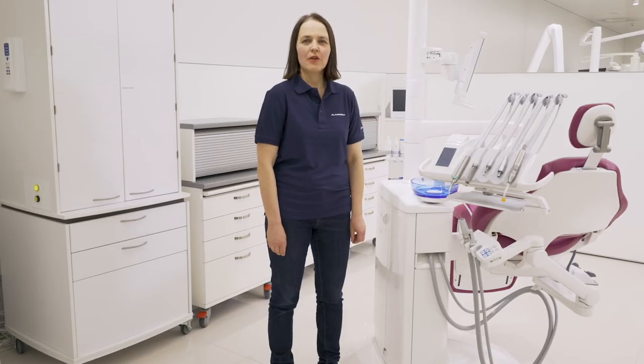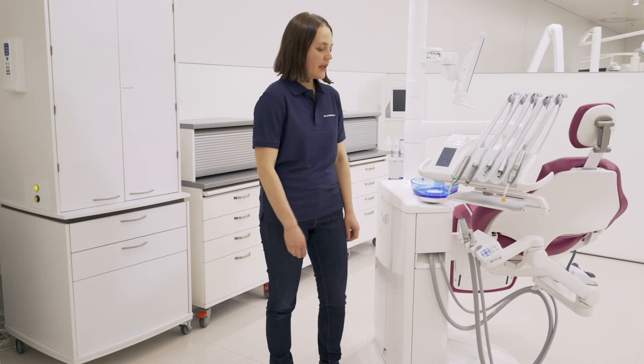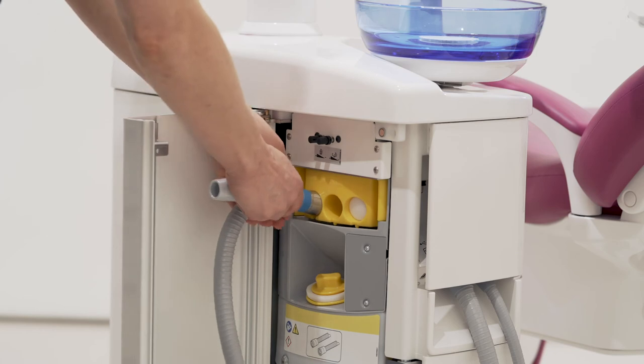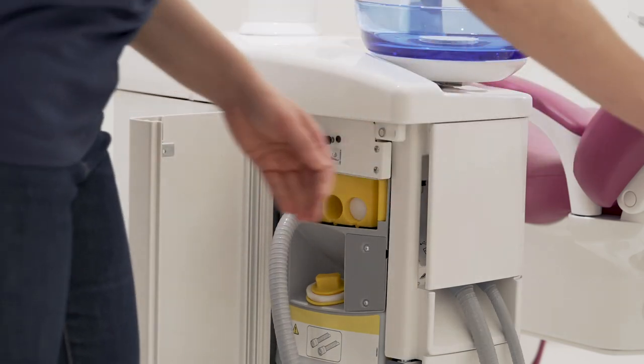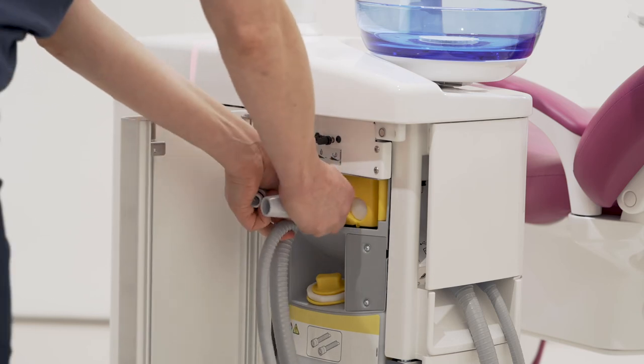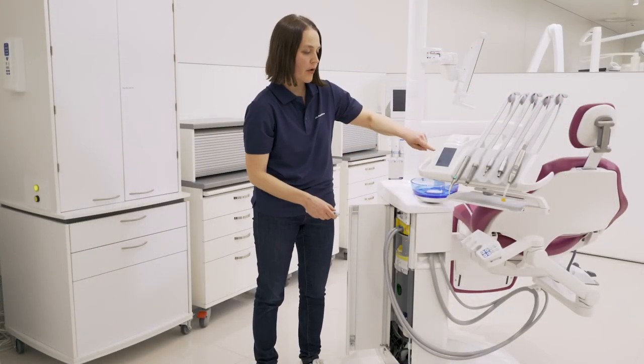In the PlanMeca Compact i5 unit, there is an integrated suction tube cleaning system. At the end of the working day, you just plug the suction tubes in and start the program.